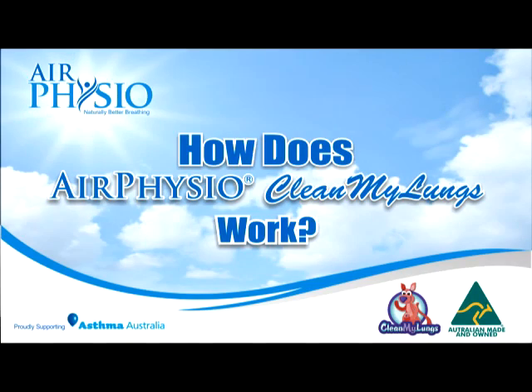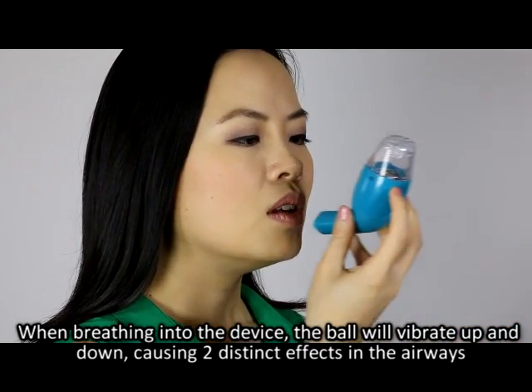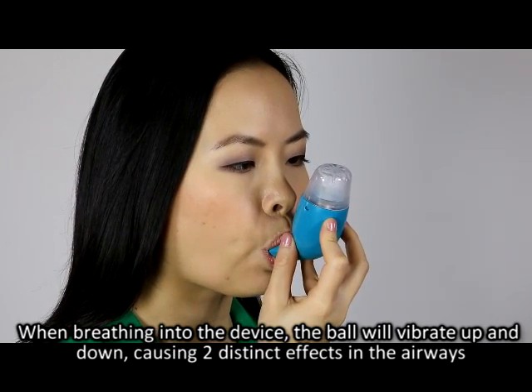How does Air Physio Clean My Lungs work? When breathing into the device, the ball will vibrate up and down, causing two distinct effects in the airways.